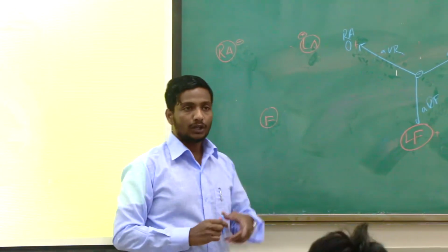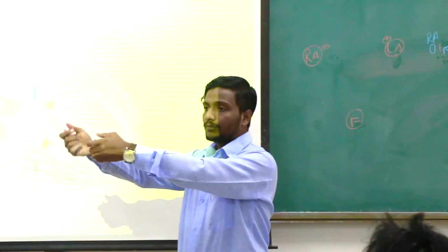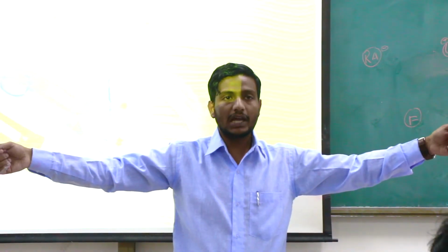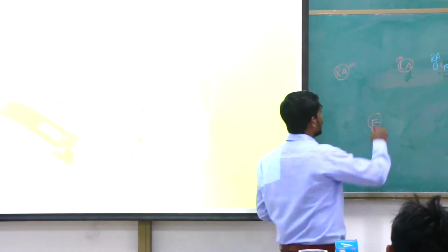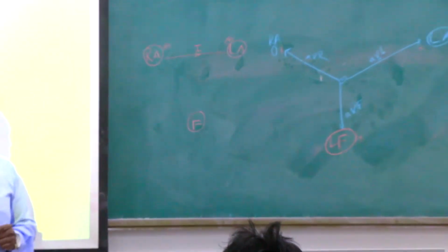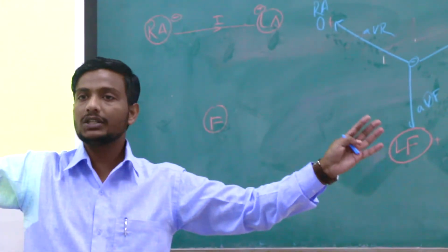Okay, you people tell me, for this particular electrode, going from the right arm to the left arm, what will be the axis? Right arm to the left arm, because it has to go from negative to positive. Clear to you? Yes, sir. Okay, so this is going to be the first lead. And this one has been given one name, what do you call it? Lead 1. So lead 1 goes from the right arm to the left arm. And this is already fixed in the ECG machine.